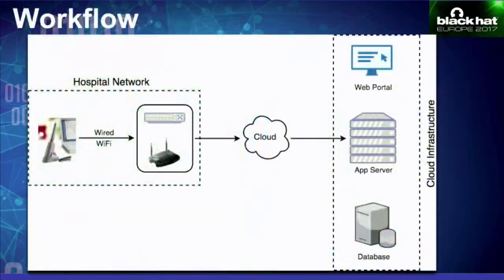Right. So I've tried to create the workflow for that particular device. It would typically be on a hospital network, connected to the hospital's private network using wireless or Ethernet. And then once it captures data or the prescription, it breaks out to the internet using the hospital's enterprise gateway, and that data is stored on the cloud.